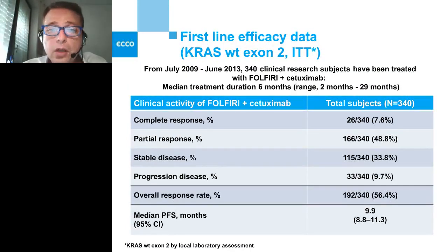And in these samples, we were able to identify 206 mutations distributed in 14 genes out of the 22 included in the panel. In particular, we found at least one mutation in 124 cases out of 182, so in the 68%, whereas almost 32% of the cases showed no mutation for any of the 22 genes that we analyzed.